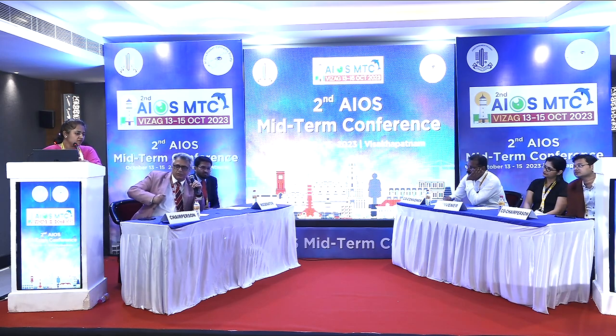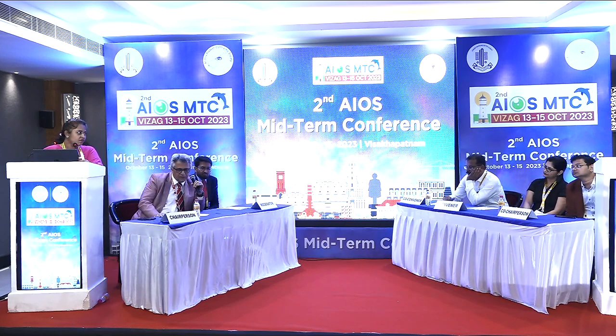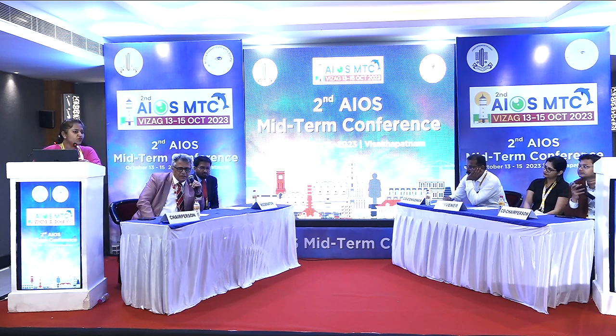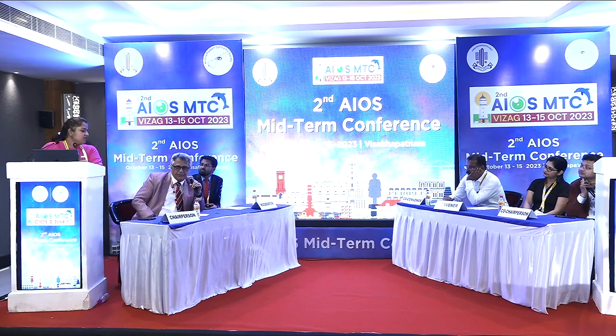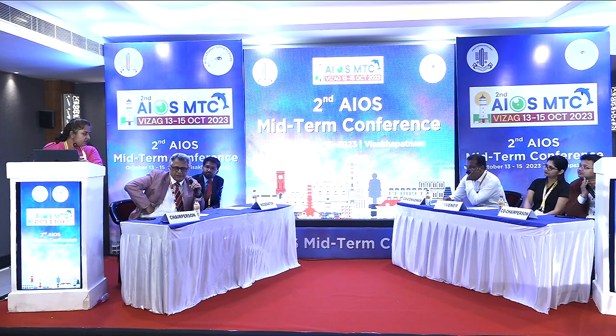Normally Candida will be whitish, and what I have seen is a slightly whitish, fluffy kind of lesion. This was fluffy to start with, but I am saying only because of the color. I pay a lot of importance to color also. But I think, on cryo, you have done an excellent job.